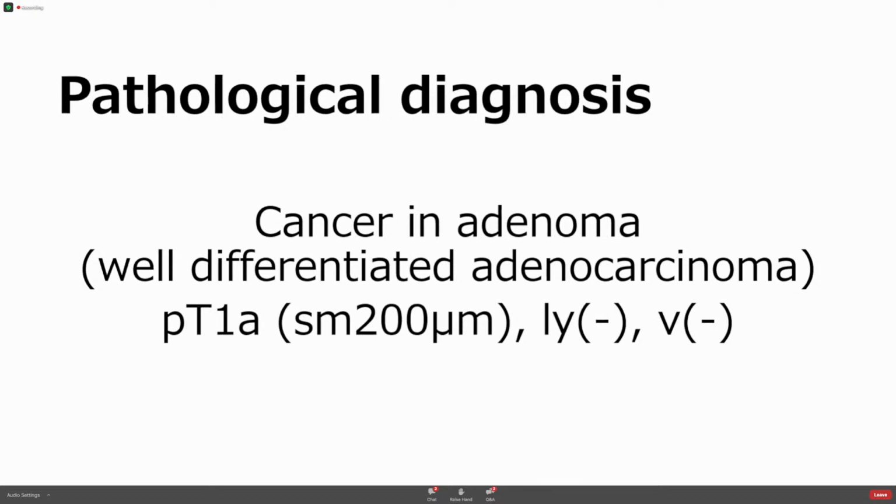In this case, fortunately, the depth of invasion is only 200, and Professor Kamura's diagnosis is correct. But I think for some villous tumors, prediction of the depth of invasion is very difficult by magnified endoscopy, because in a villous tumor the surface is preserved, but the worst histology occurs in the bottom of the villous tumor, and sometimes cancerous cells transform to mucinous carcinoma and invade the submucosa.